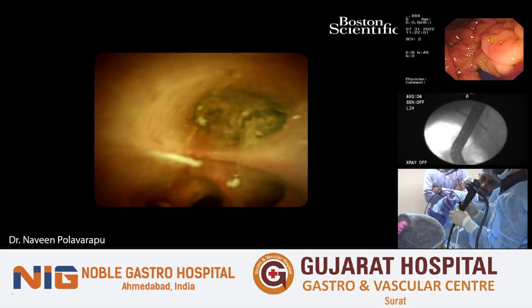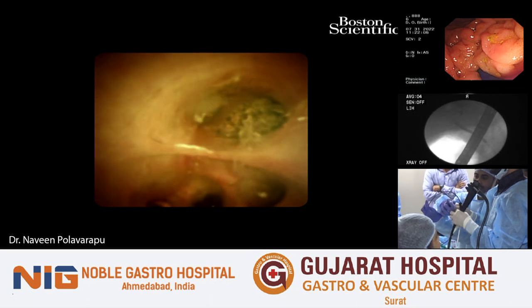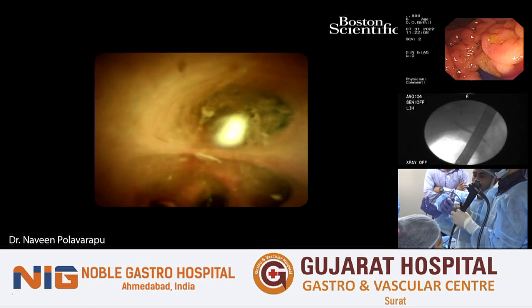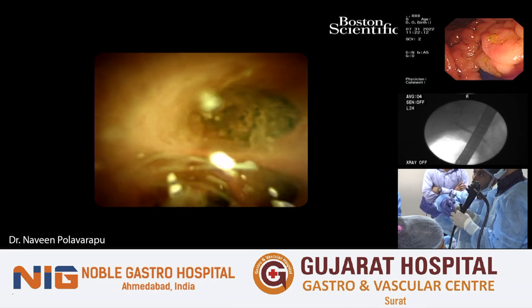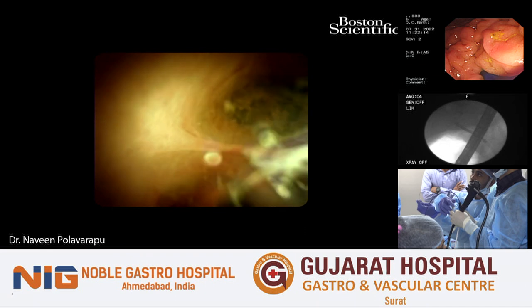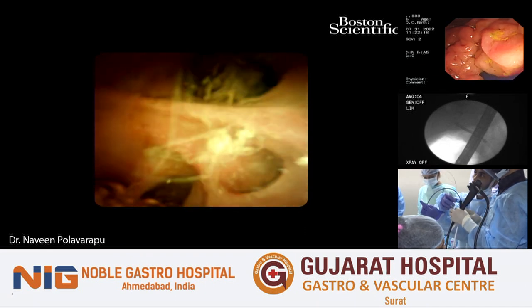Do you think while breaking, the stone will move into the intrahepatic duct? Intrahepatics, yes, that's a possibility. There's a strong possibility. And these kinds of small stones are always notorious because they try to migrate. All these mobile stones are very, very challenging to take out compared to an impacted stone.